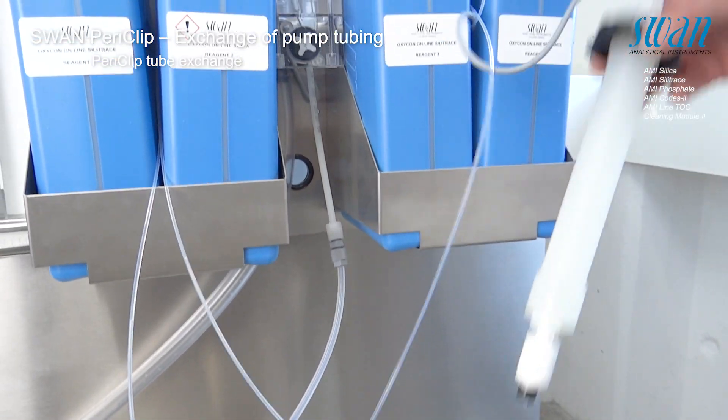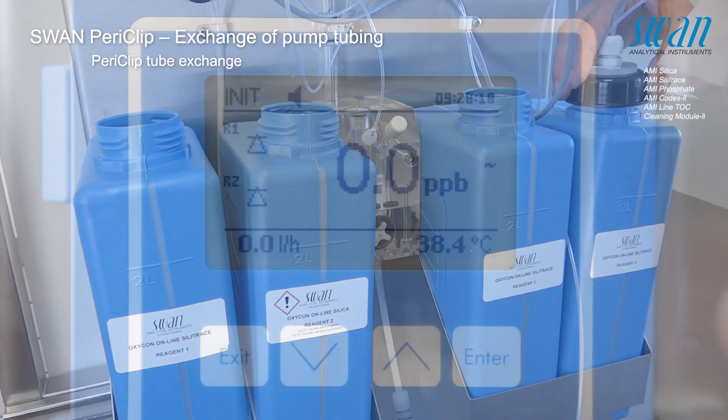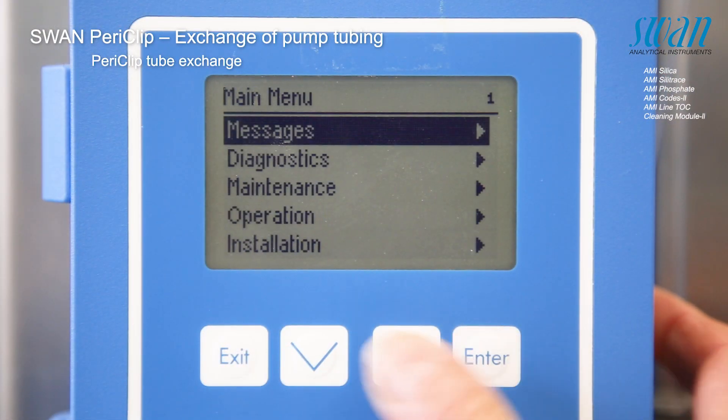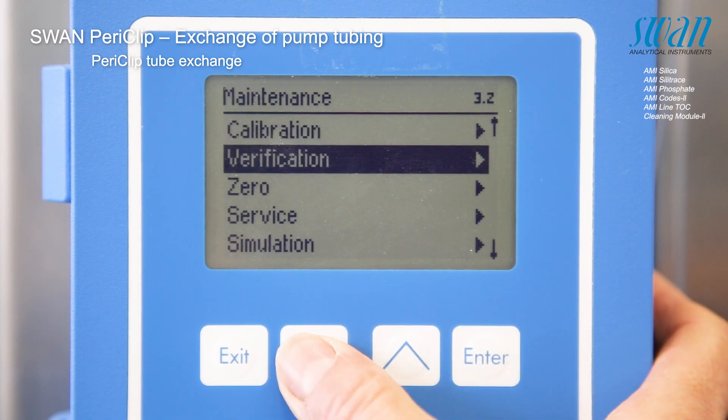Place the suction lances in the corresponding reagent containers. Start the fill system procedure and observe if the tubing is filled completely with liquid and without any air bubbles.